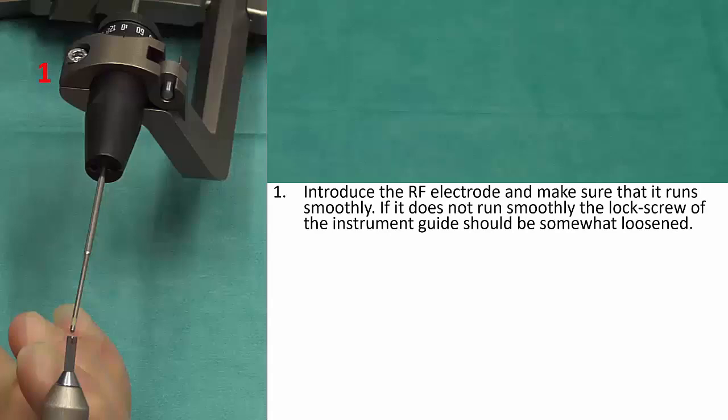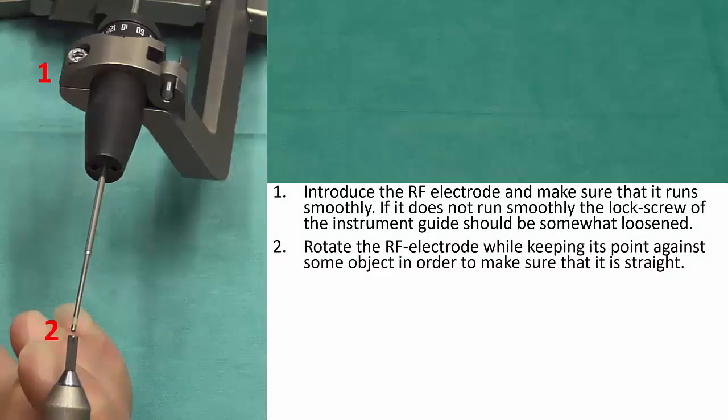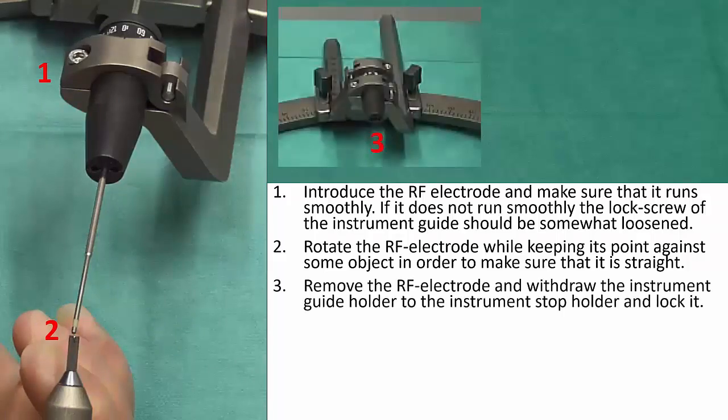Then introduce the radiofrequency electrode and make sure that it runs smoothly. If it does not run smoothly, the lock screw of the instrument guide should be somewhat loosened. Rotate the radiofrequency electrode while keeping its point against some object in order to make sure that it is straight. Then remove the electrode and withdraw the instrument guide holder to the instrument stop holder and lock it.